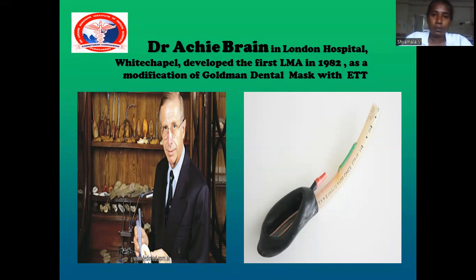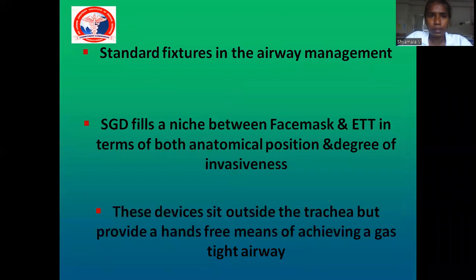Archie Brain in London Hospital first developed the LMA in the year 1982. Yes, Archie Brain. It is the standard fixture in airway management. As I told, it replaces the endotracheal tube, so we are maintaining the airway by using supraglottic airway devices.